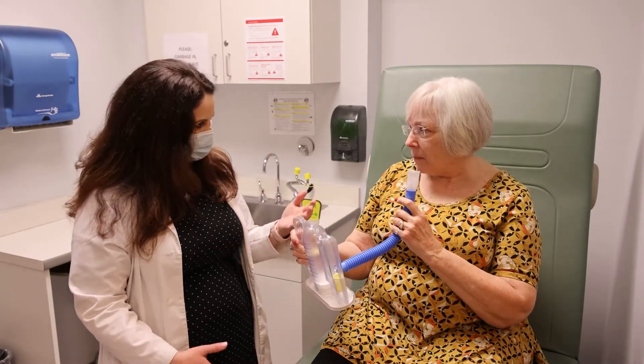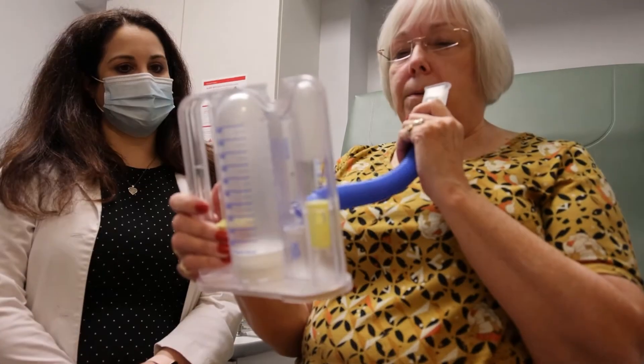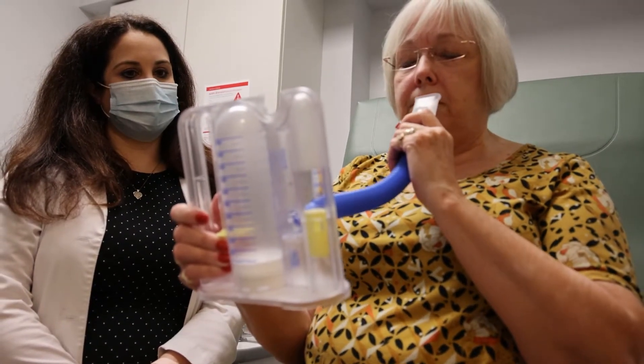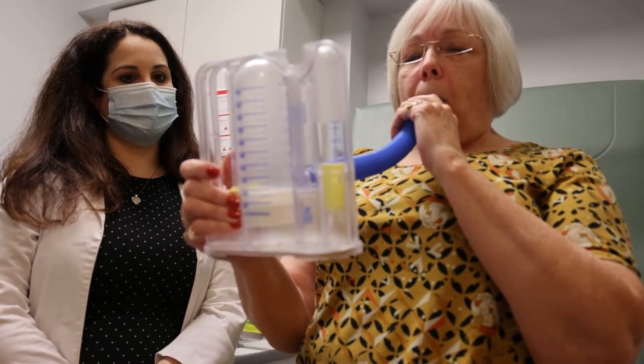Once you're done, take your mouth off and exhale all of your air normally. While you breathe in, you're going to watch the yellow valve on the side. You want to float it between the good, better, and best sections.